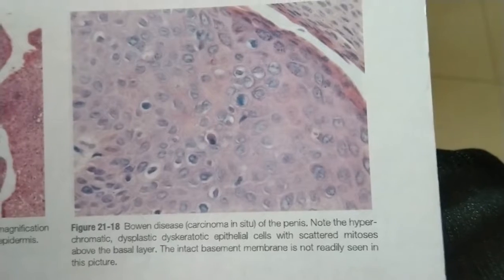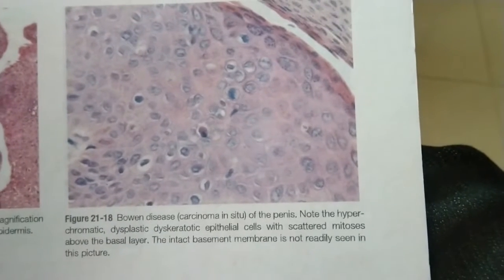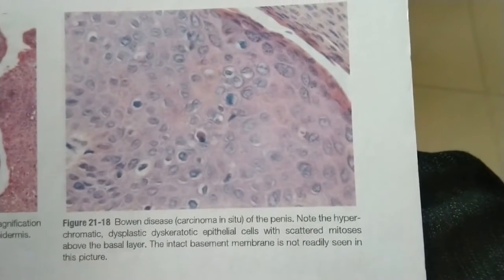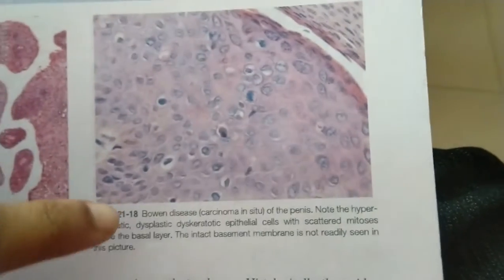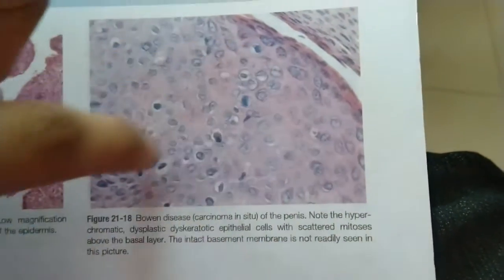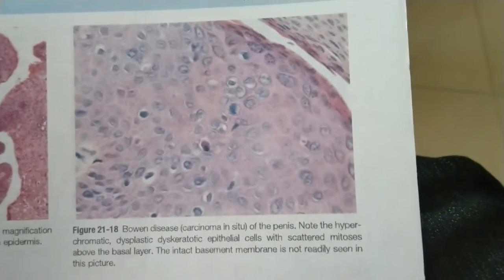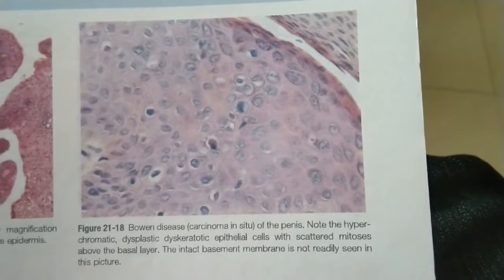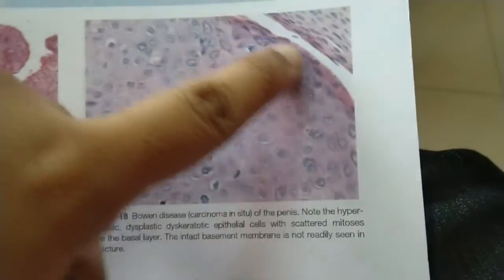This is the picture showing Bowen's disease, or carcinoma in situ of the penis. All these cells show nuclear cytoplasmic atypia, dysplastic and dyskeratotic epithelial cells.